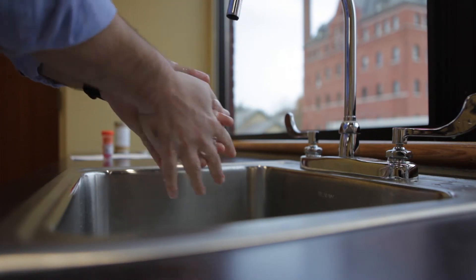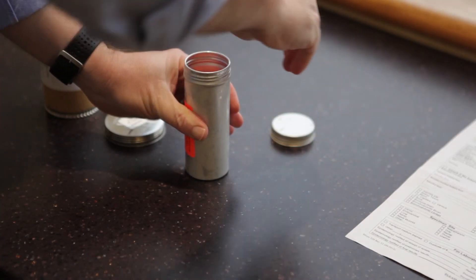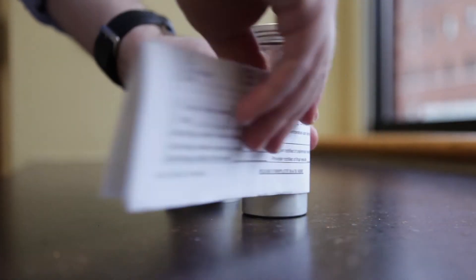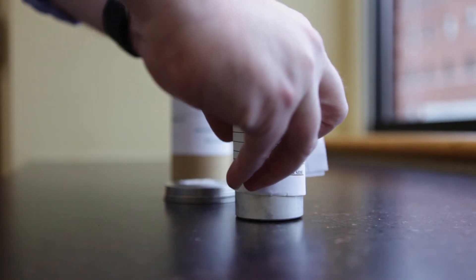Then wash your hands. Put the plastic vial into the metal canister. Wrap the form around the metal canister and put both in the cardboard container.